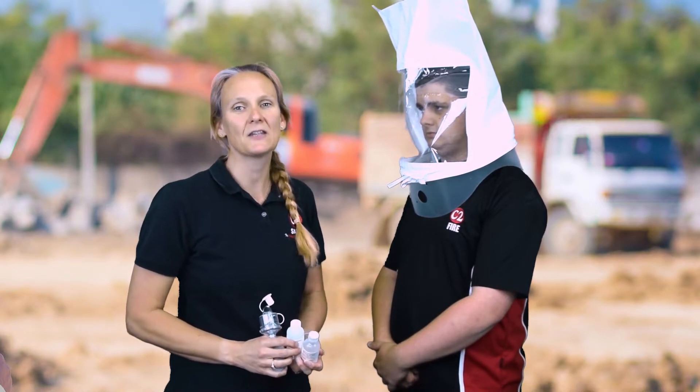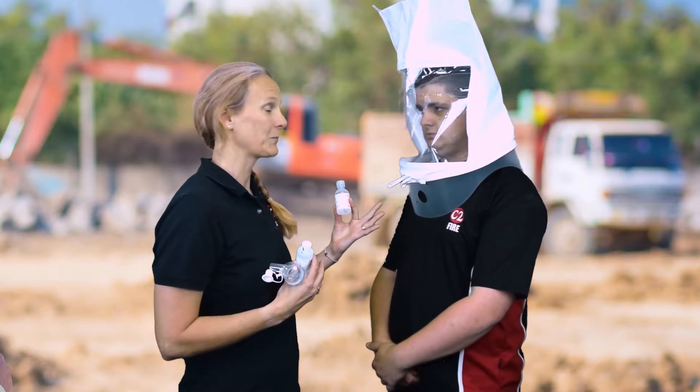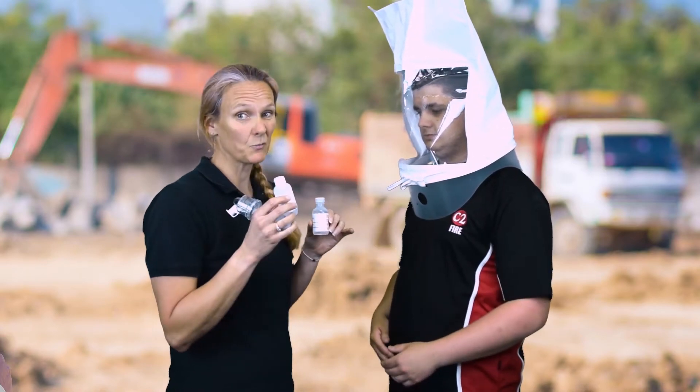The next stage in the face fit test is to perform a sensitivity test. We generally have two solutions that we can use. Which one we use depends on the answers given from the participant regarding allergens. So as Tom has no allergies, I've already decided which one to use for him.